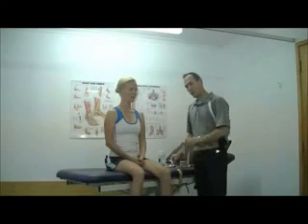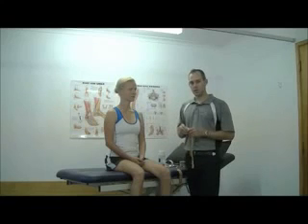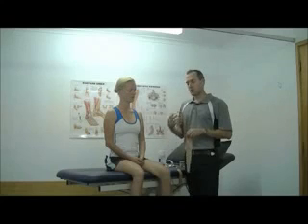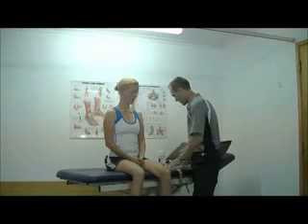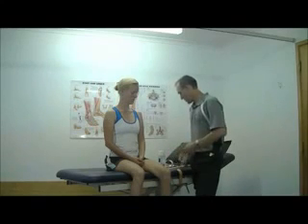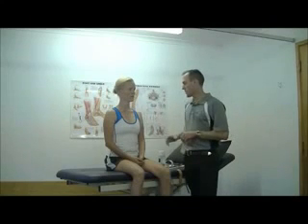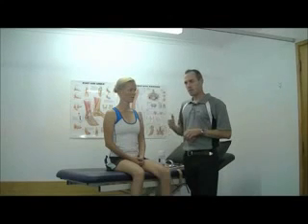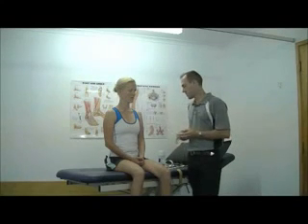Now, there are a few important principles or tips to make sure that you get optimal adhesion with your dynamic tape. It is a heat-sensitive glue. It's important, therefore, that you give it a good rub once you've finished applying it. As with most tapes, it doesn't like creams or dirt, oils, those sorts of things. And also, it doesn't bond well to hair, so it's important to remove the hair. Generally, a set of clippers is ideal for this purpose, as you're less likely to get an irritation on the skin from using a razor, for example.